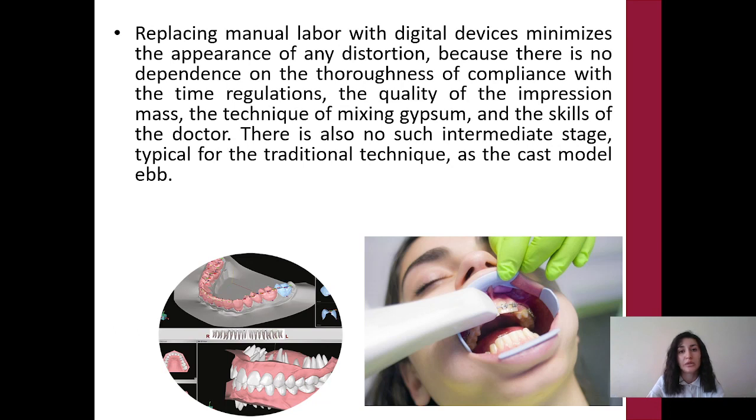Replacing manual labor with digital devices minimizes the appearance of any distortion, because there is no dependence on compliance with the time regulations, the quality of the impression mass, the technique of mixing gypsum, and the skill of the doctor. There is also no such intermediate stage, typical for the traditional technique, as the cast model.